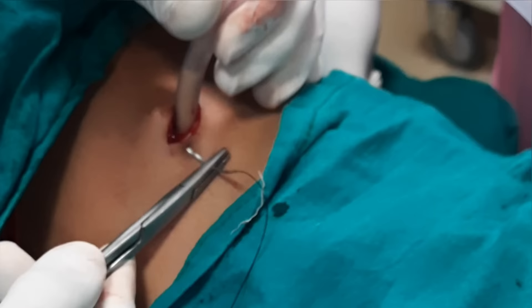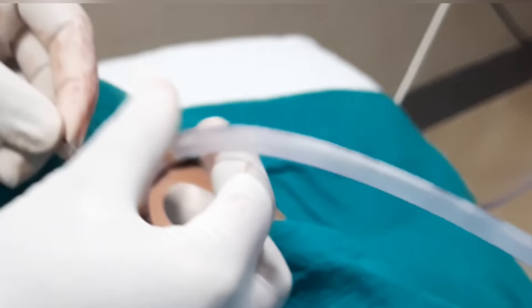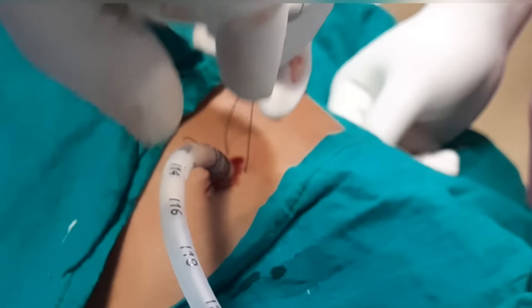We put two sutures — one on the anterior side and one on the posterior side. We fix the chest tube with these sutures so the ICD will not come out. We tie the knot on the chest tube, and do the same on the posterior side. By fixing from both sides with sutures, the chest tube is secured tightly so it will not be accidentally removed.